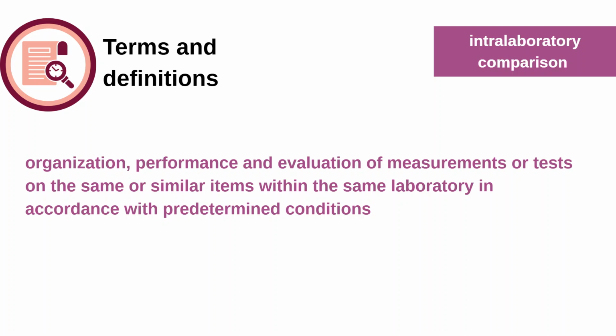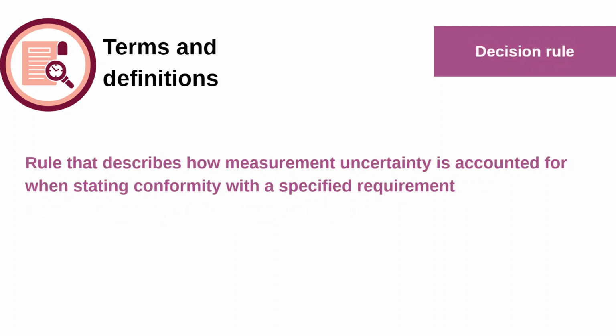So at this point, I would like to tell another important terminology which is not mentioned here. There are the analyzers, which are the equipment with which we perform testing, and the one on which testing is performed is called the unit under test or device under test. We usually write it as DUT or UUT. That depends.